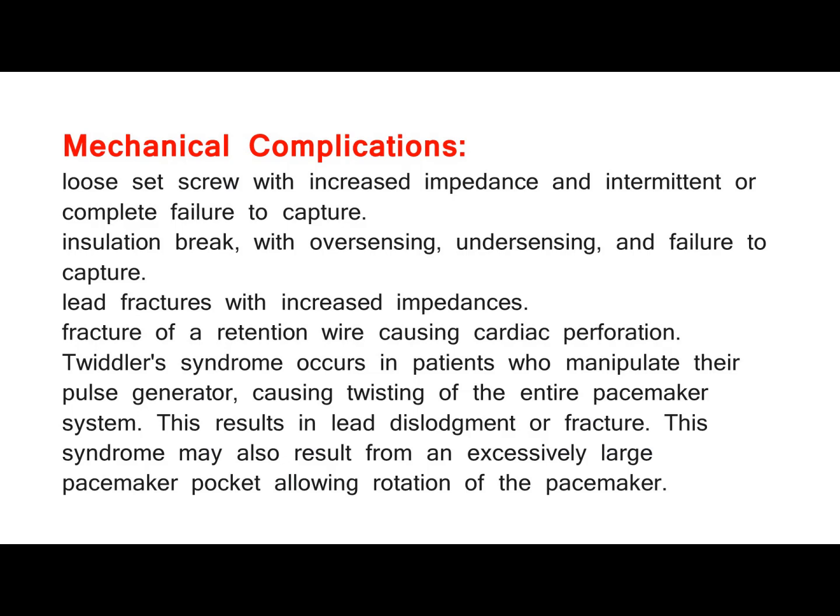Twiddler's syndrome occurs in patients who manipulate their pulse generator, causing twisting of the entire pacemaker system. This results in lead dislodgement or fracture. This syndrome may also result from an excessively large pacemaker pocket allowing rotation of the pacemaker.